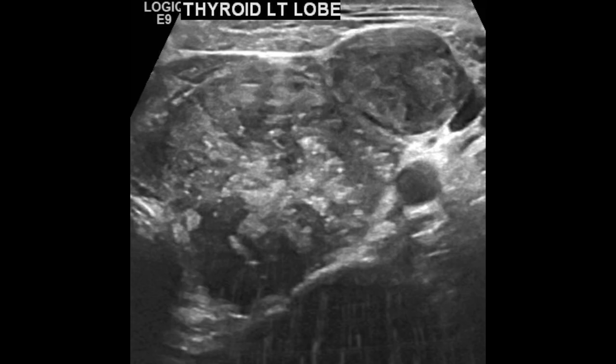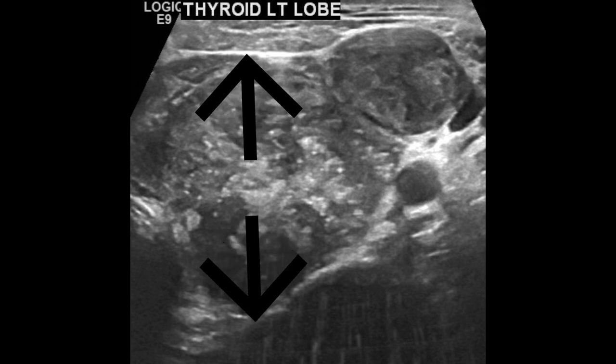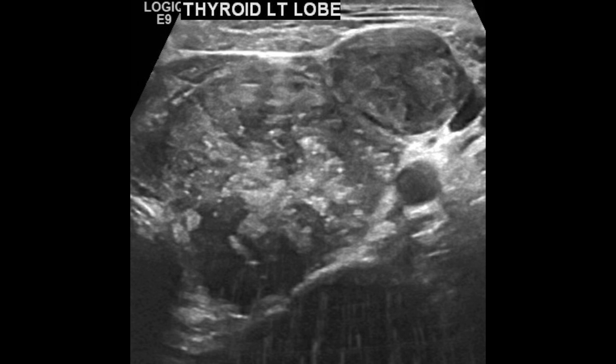Always keep in mind that when a nodule is taller than wider, it means it may invade the surrounding structures. In this case, there is tumor thrombus within the left internal jugular vein.